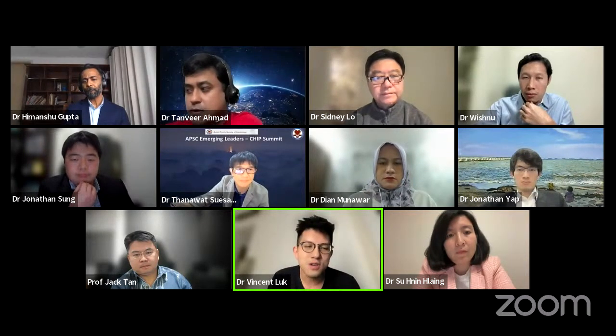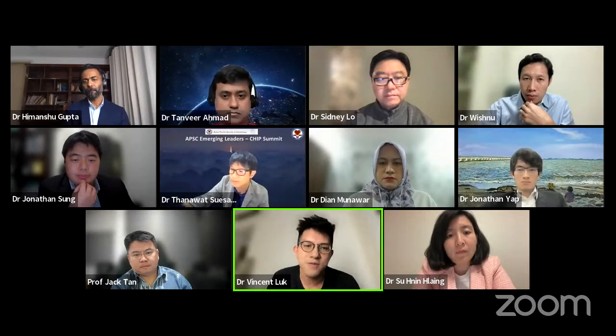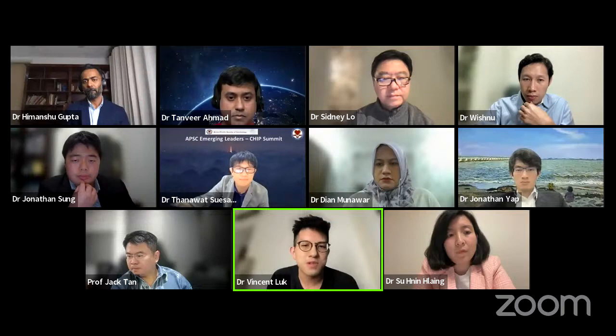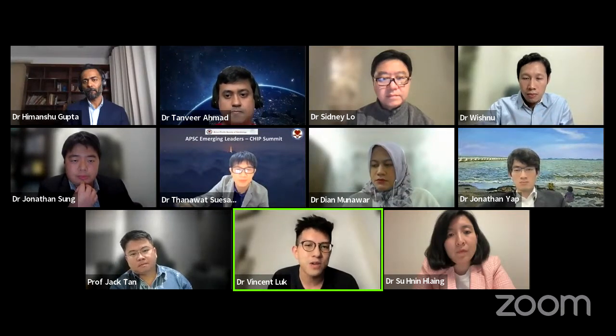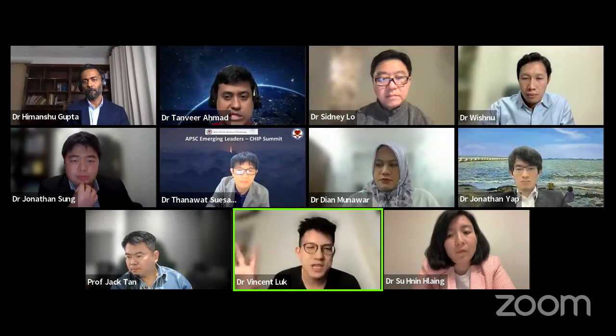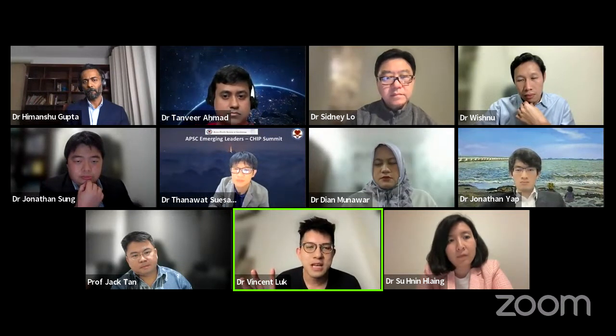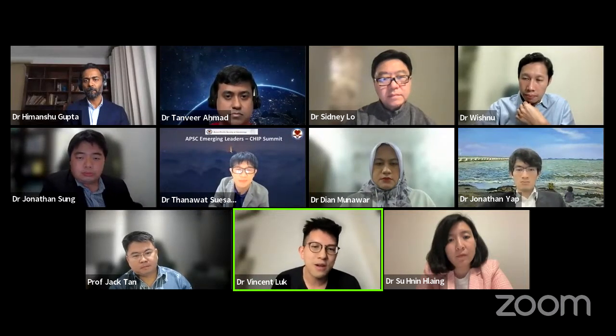So to me, I also learned from colleagues from the US that if you go for diamondback cases, probably you don't need a very high pressure balloon, or your high pressure balloon can only go up to 10 to 12 atmospheres, and that would be good enough. And that kind of changed my thoughts, because for some time I liked to see those bad dissections, because I knew my stent would go in, and I would stent it anyway. But with time, I changed my belief a little bit. I would be happy to hear other panelists or experts give their approach or opinion.